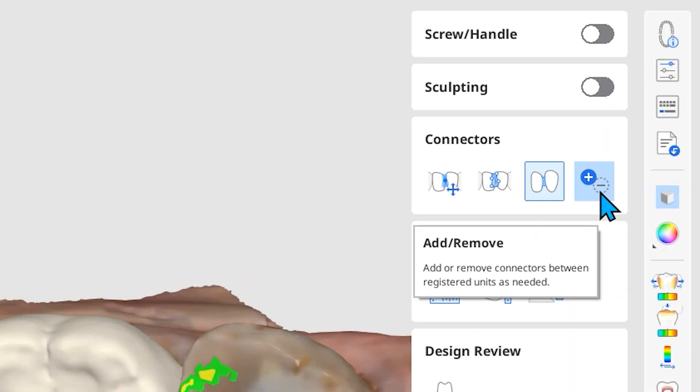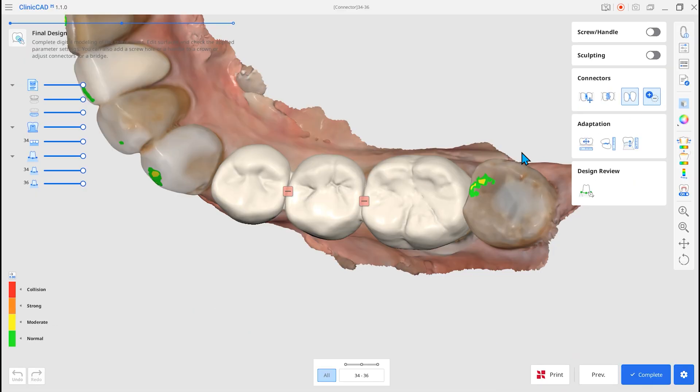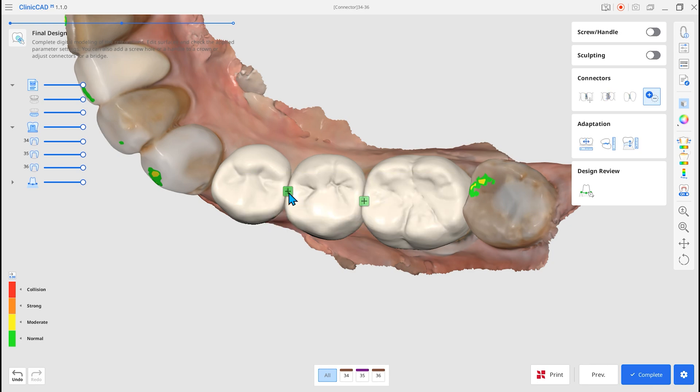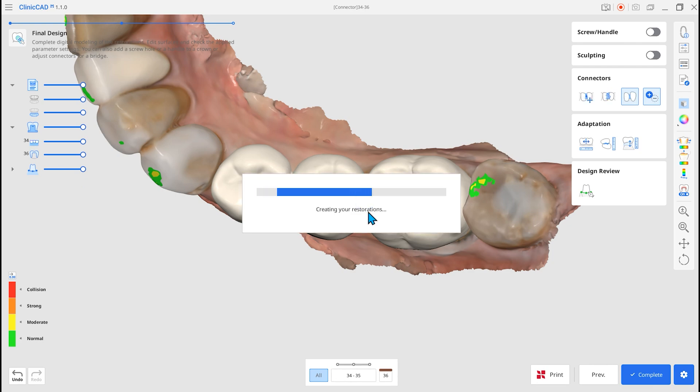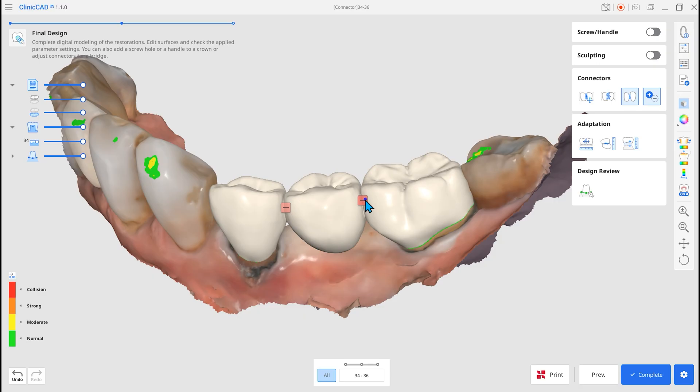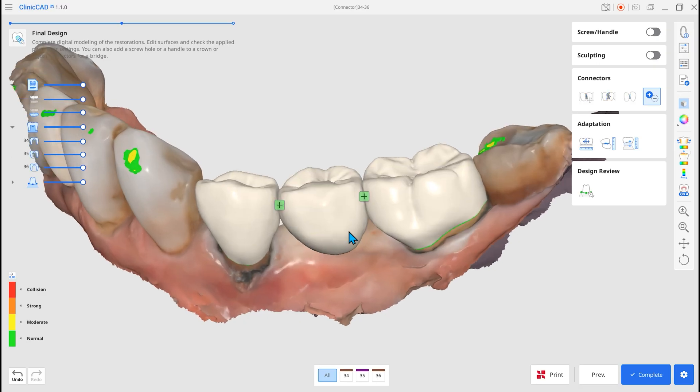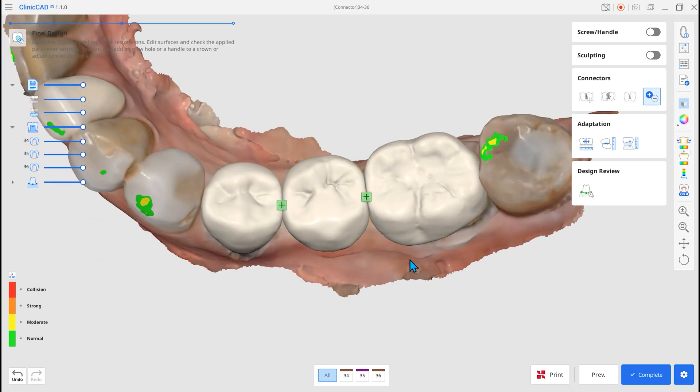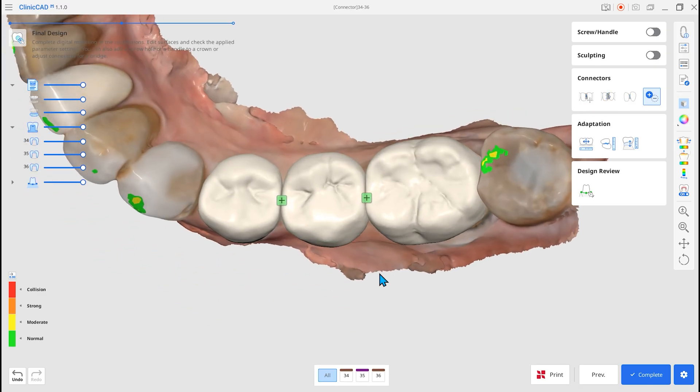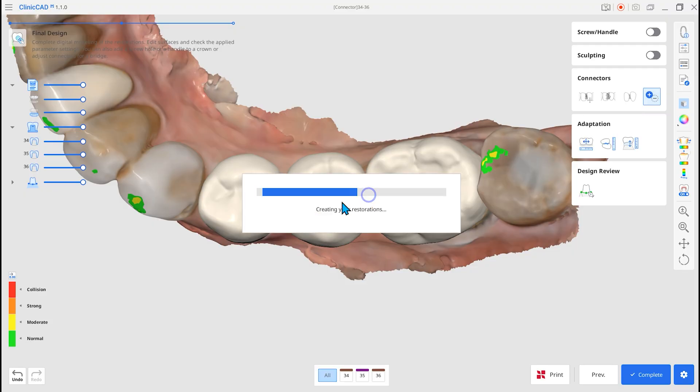Use the Add, Remove to easily add or delete connectors. Create connectors with minimal area while preserving natural tooth anatomy and add or remove them easily.